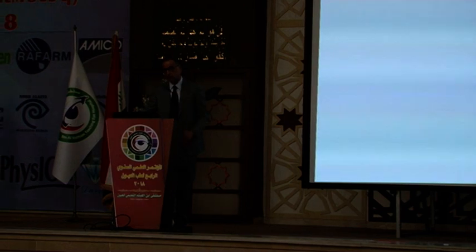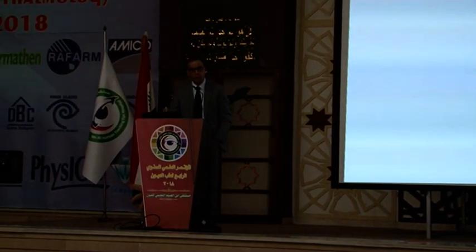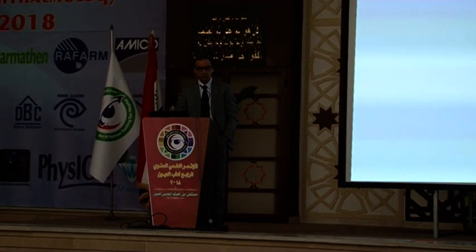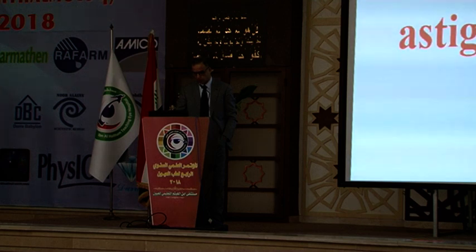As we know, preoperative corneal astigmatism has been reported in about 50% of patients before phacoemulsification, and cataract surgery or phacoemulsification is now regarded as a type of refractive surgery, so our aim is to eliminate all astigmatism, even if the astigmatism is low.